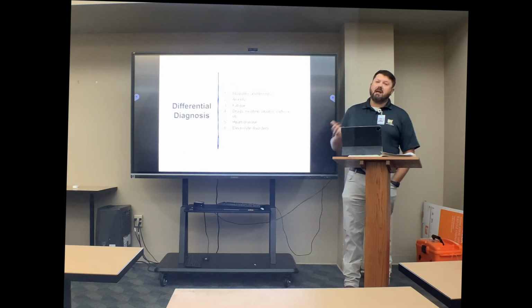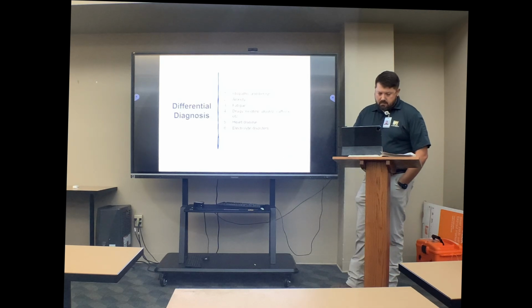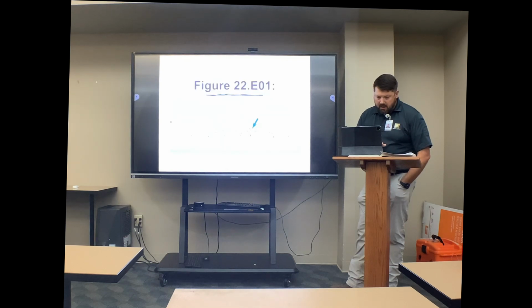A lot of the same things that can cause irritability within the heart: anxiety, fatigue, stimulants, heart disease, electrolyte disorders. All right? So let's take a look at a couple of them. All right? So figure 22, example 1.